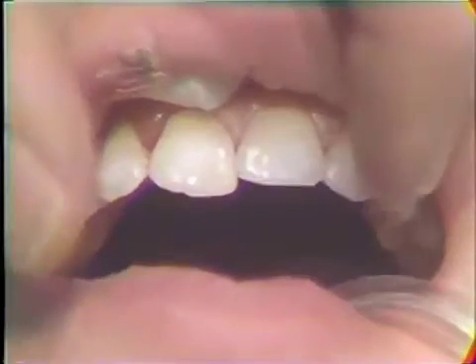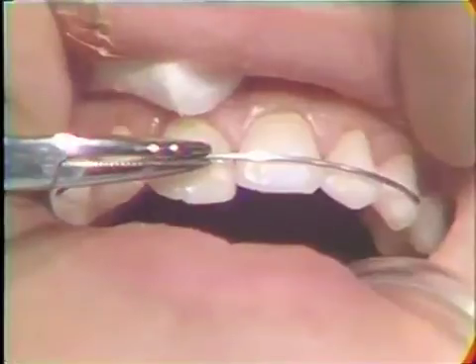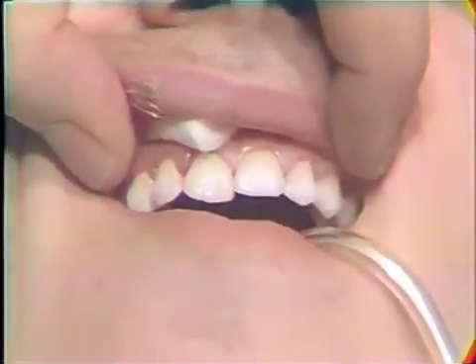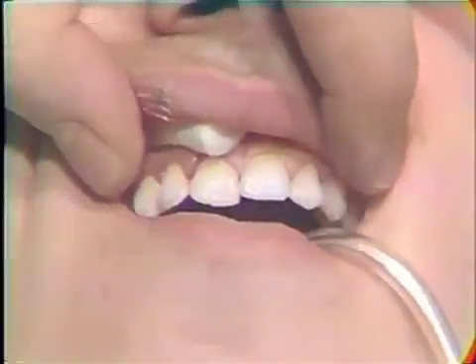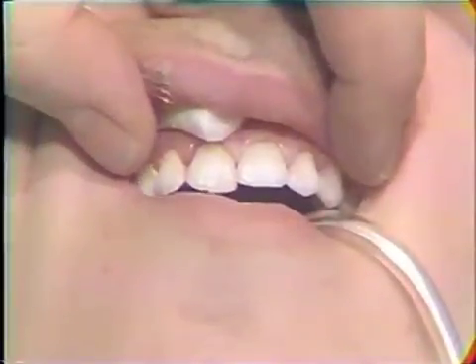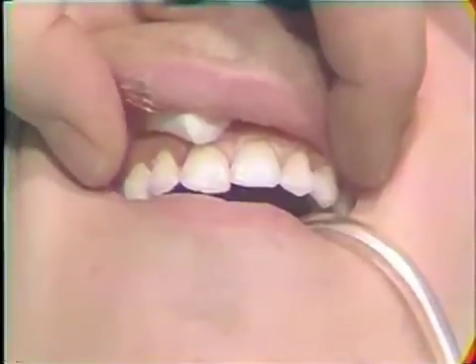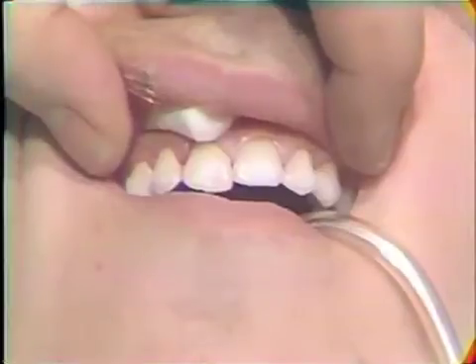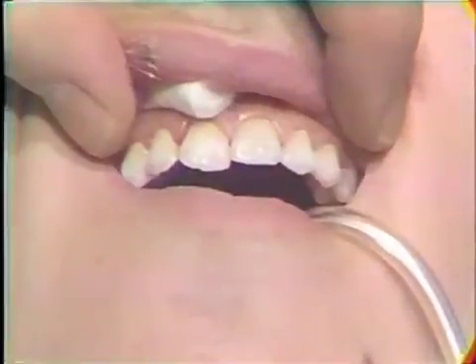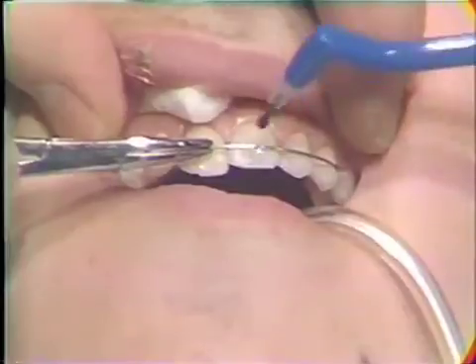We'll take our wire again and test it against the teeth one last time to make sure everything is positioned correctly. It's important at this point not to let your fingers touch the teeth while holding the wire, as that will ruin the etched area. We're using J&J's Acid Glaze, a system with two liquids. We take a couple drops of each, mix them together, and apply the material to the tooth. We'll start with the left central incisor since the wire tends to contact that tooth most securely. After placing resin on the tooth and waiting a moment for it to start setting, we place the wire in position and add more resin.